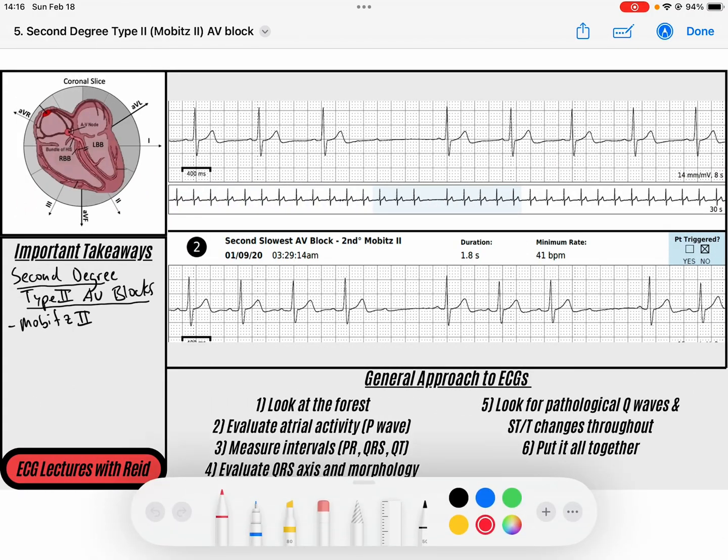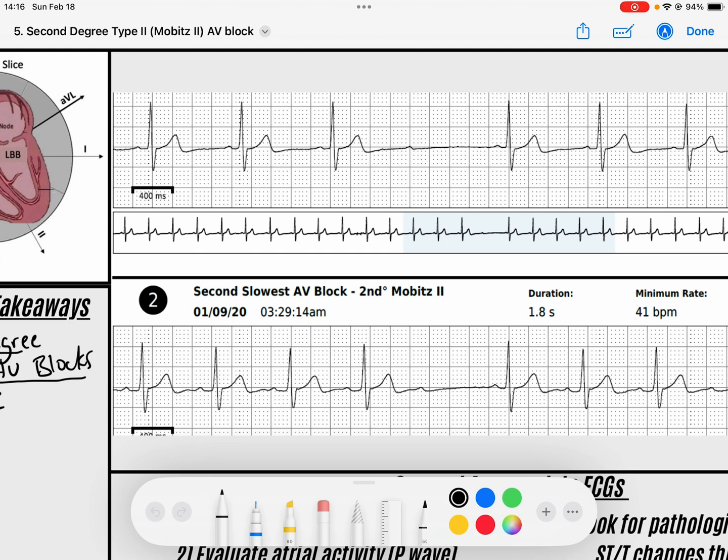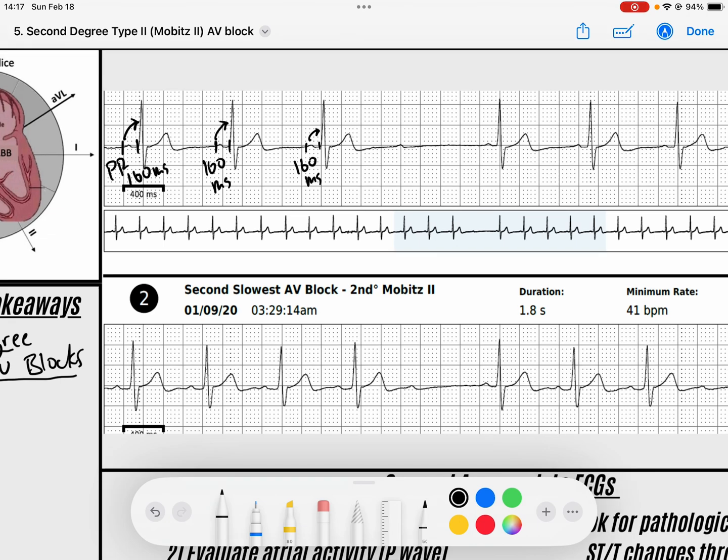That means my PR interval will stay the same until it doesn't, until the P does not conduct to the QRS. That's because the bundle of His is all or nothing conduction. These people have lesions within their bundle of His. Let's take a look. These are a couple of Holter monitors, wearable devices. What we see here is that we have this P wave conduct to a QRS, and that PR interval is normal, about 160 milliseconds. Then we see a P conduct to that QRS with a PR interval that is still 160 milliseconds. Then we have this P conduct to this QRS with a PR interval that is still 160 milliseconds, and then the next P does not conduct to that QRS.